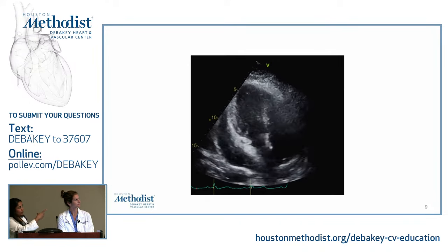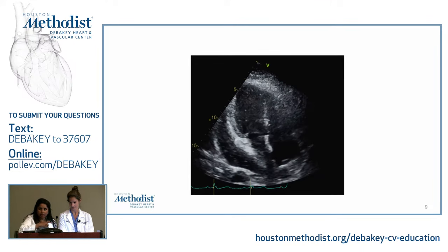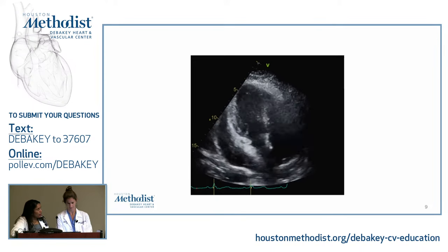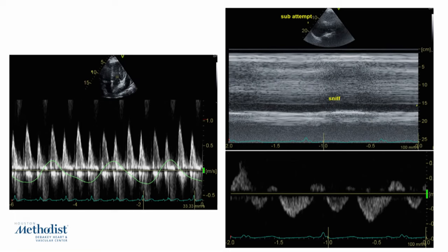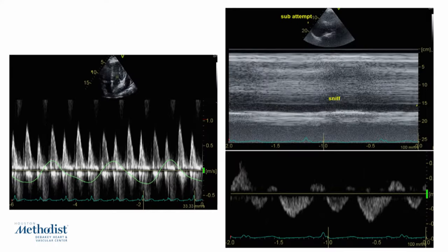So that's important to recognize. And in this case, again, if you pay attention, there is that LV and the LA collapse here, right? So that's again another regional kind of tamponade situation, which you should be alerted about. Again, you're going to see those classic signs, but again, might not be exactly, because the patient can be diuresed and is probably on BiPAP. In this case, the patient is having some respiratory distress. So remember those features too, right? Clinical diagnosis is what is important.